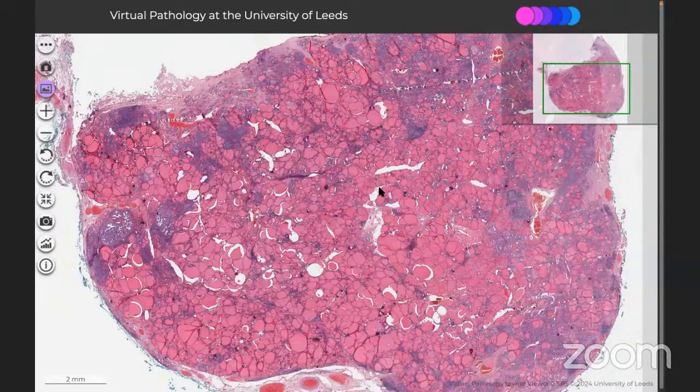Okay, and just to refer to a few of the data set items, you need to say that it is a well differentiated thyroid tumor, and you are excluding any area of necrosis, you are excluding any areas of higher mitosis. You can take the help of Ki67 in that case. And obviously it should be noted that there is no angioinvasion, lymphatic invasion, or perineural invasion. So these are the common data set points you need to mention when you are having a dissection specimen per se. And you say that it is a multifocal papillary carcinoma of thyroid.